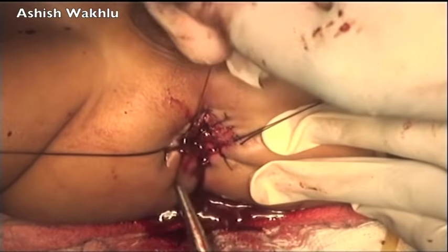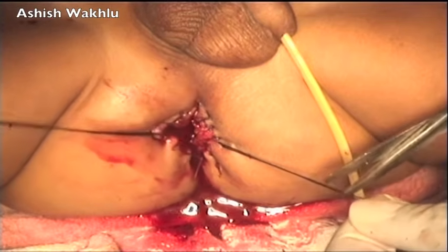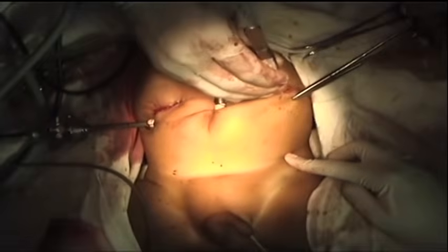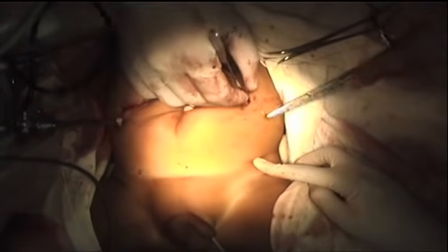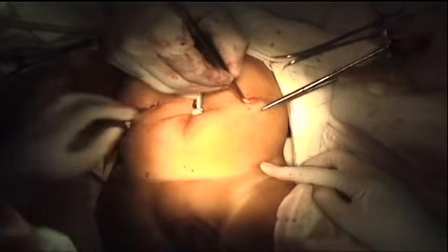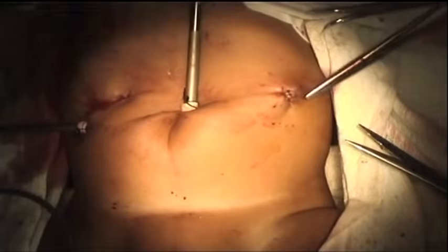So these are the last few sutures to complete the anoplasty, and we then remove the two traction sutures. The next part of the operation is to resite the mobilized colostomy at its proper place in the left iliac fossa. So for this we closed off the site of the left hand trocar.